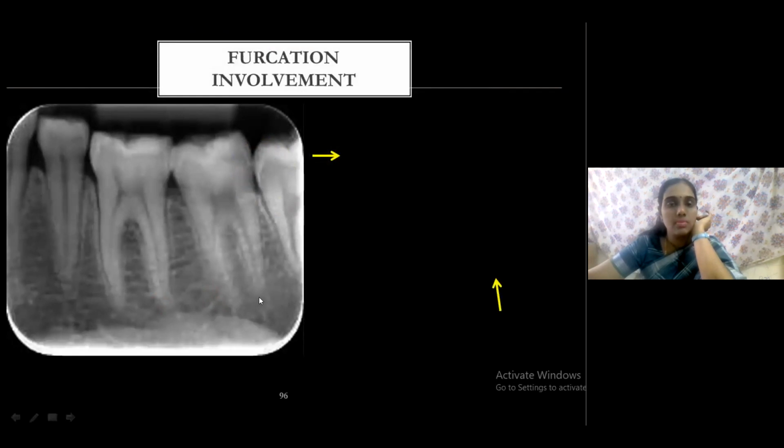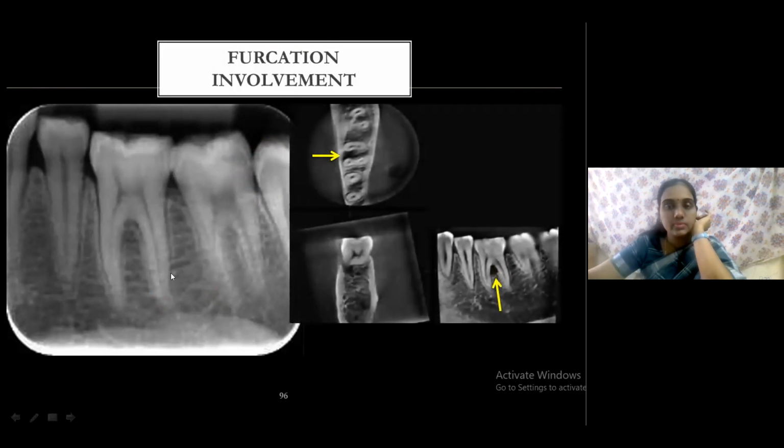This is an intraoral periapical radiograph, which shows mild widening of the periodontal ligament space in relation to the 6, present in the interradicular region. Now you can see the CBCT sagittal section. See, there is bone loss. Of course, the periapical will not serve the purpose, and this 3D radiology definitely gives a better picture of the condition of that tooth and the bone loss.